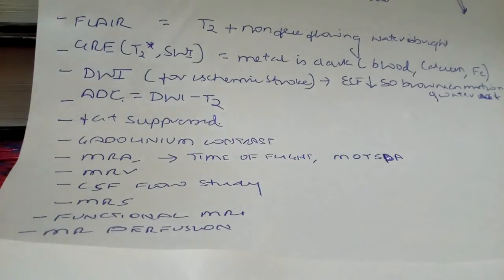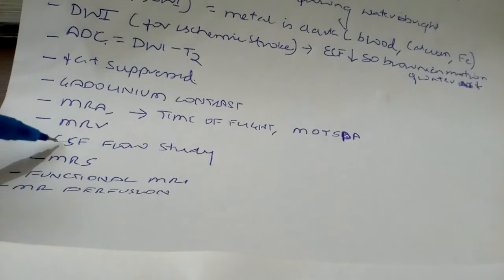MR venography has similar principles to MR angiography, and CSF flow study also has similar principles to MR angiography. These are mostly for academic purposes.